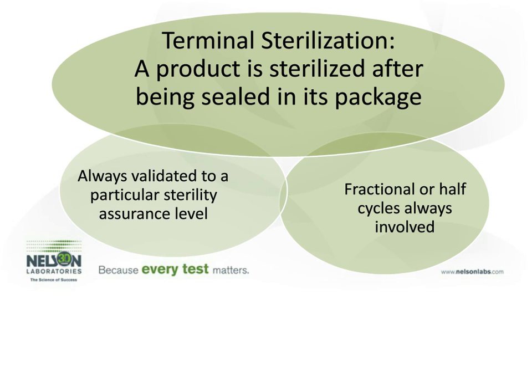Now, with terminal sterilization, just to make sure we're on the same page regarding definition, a product is sterilized after being sealed in its final package. And anytime that we are talking about terminal sterilization, there is always associated with that a particular sterility assurance level which has been determined. And also, in validation of that sterilization process, we are always doing some type of fractional or half cycle.